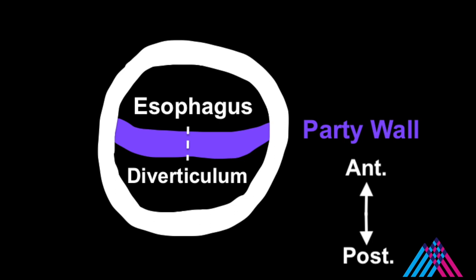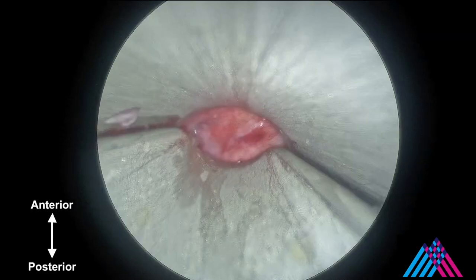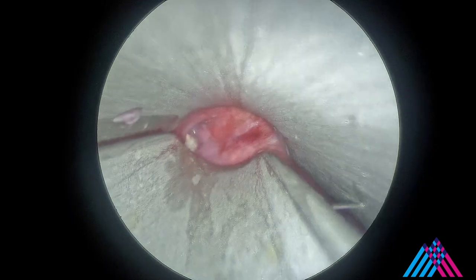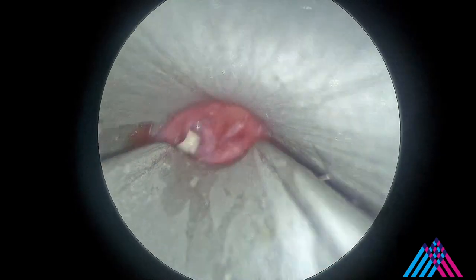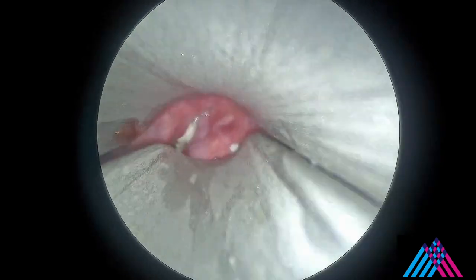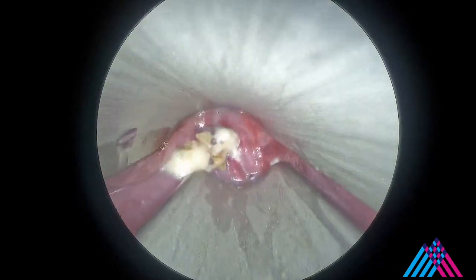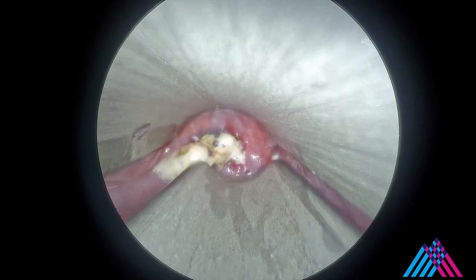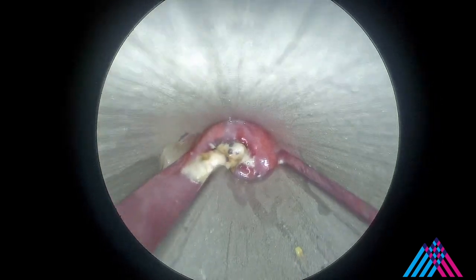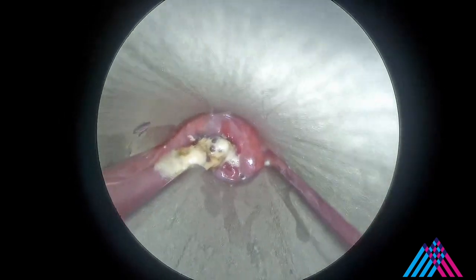When looking from superior, the esophagus will be anterior and the diverticulum posterior. The party wall will appear as the thick horizontal wall of tissue. A Weerda bivalve diverticuloscope is placed in the post-cricoid area in the proximal esophagus. As the laryngoscope is advanced, old food particles are encountered and must be suctioned.